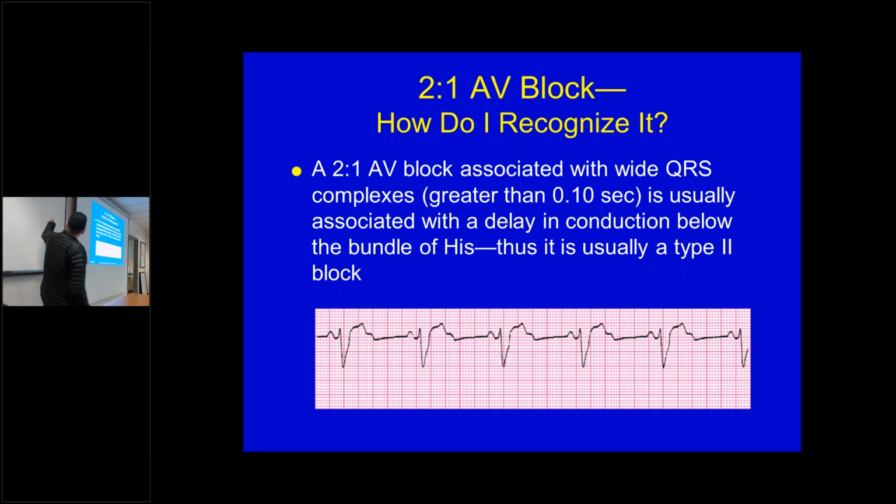So we talked about axis, right? We drew that, the circle, the heart on it, and where the leads are. You guys want me to draw that again? Do you understand? That's kind of going the wrong way.